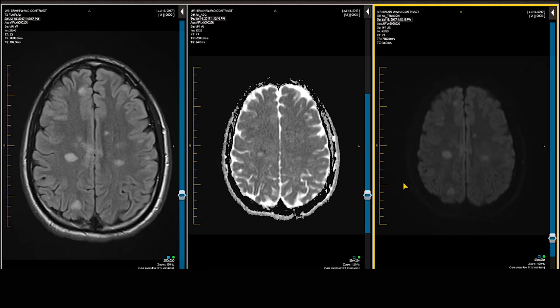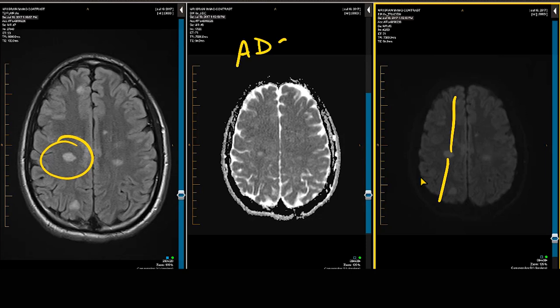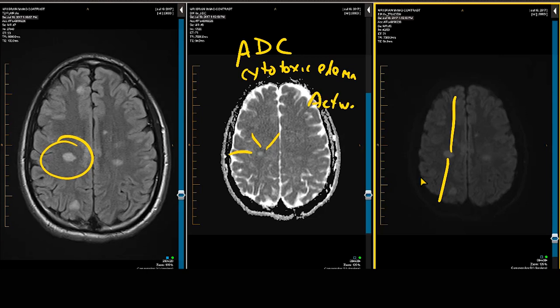Stopping on this image, the FLAIR image shows a demyelinating plaque. On the DWI it appears bright in signal intensity. However, on the ADC map there is a small area of dark signal intensity in the periphery, which might suggest cytotoxic edema and therefore an active plaque. We will also look at gadolinium-enhanced sequences to make that distinction — this is what we are looking for on the ADC map combined with the diffusion-weighted scan.